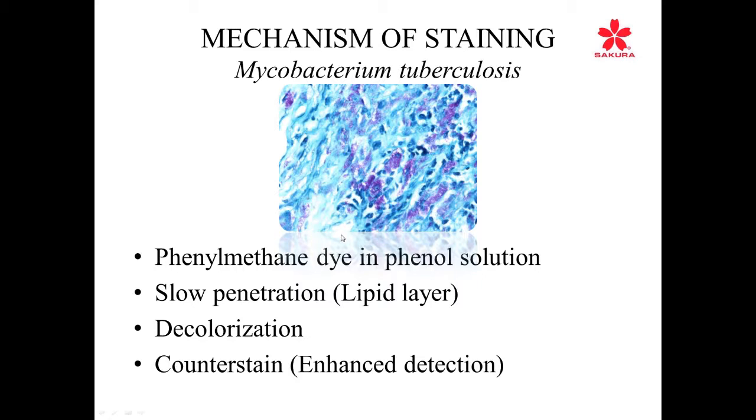And now the significant thing about the counterstain, as you can see here in the picture, is that you want a counterstain that just adds a light contrast to your organisms. Now this here is Mycobacterium tuberculosis, and this is an acid-fast stain. And the tuberculosis bacilli are staining red. And even in this, the background staining is almost too dark, because you really want these organisms, because of their very small, minute natures, to jump out at you. So I would suggest on this staining procedure here that this would be the absolute most that you would use on your background stain, if not less.